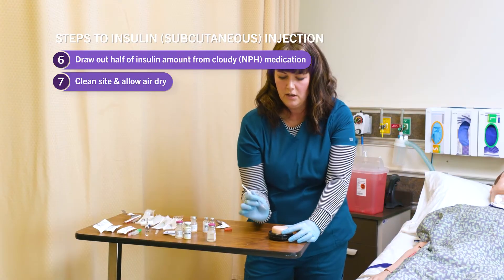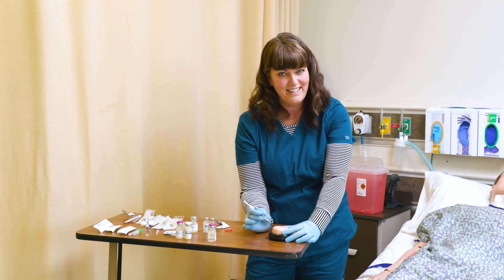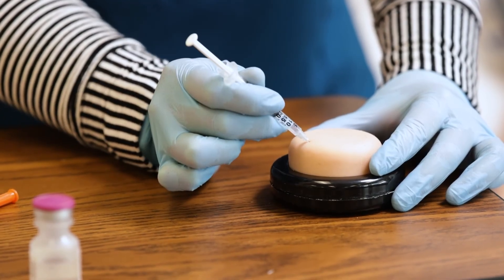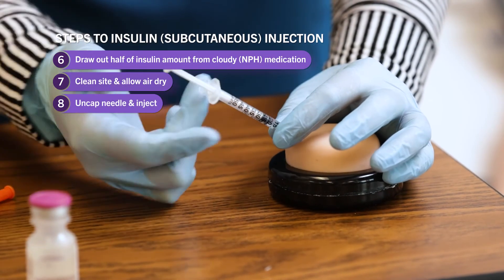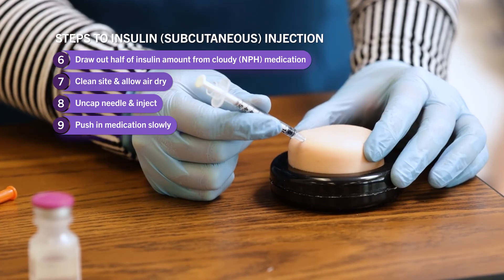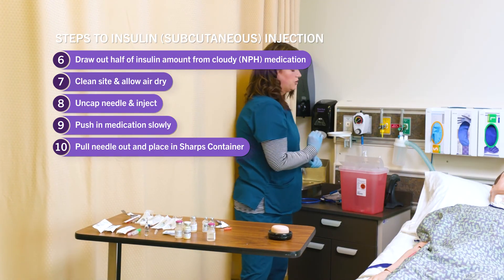When I administer my injection, I uncap the needle, hold the tissue secure, and go in at a 45-degree angle. With shots, do not hesitate — insert the full length of the needle into the tissue quickly, not slowly. You get that nice jab. Once the needle is in, I secure it with this hand and push in the fluid slowly. Wait just a moment for that to absorb, then pull back out. The dirty needle goes straight into the sharps container.